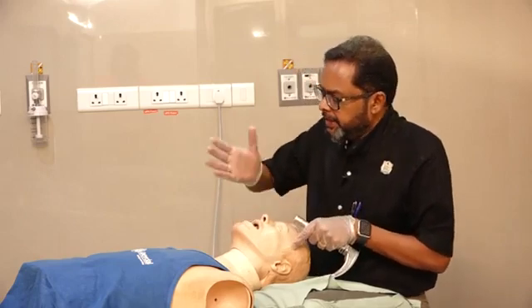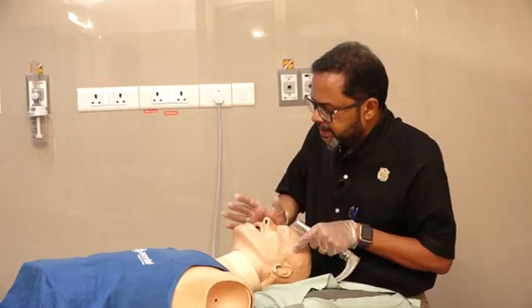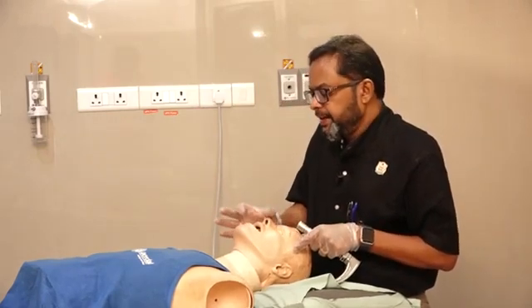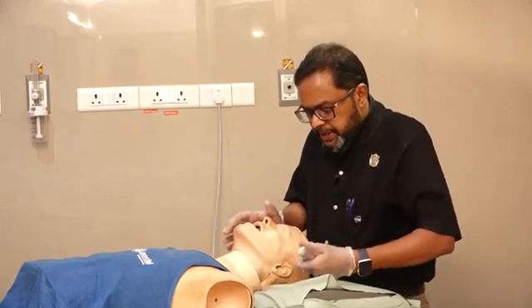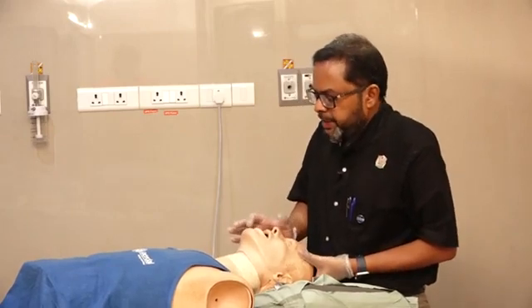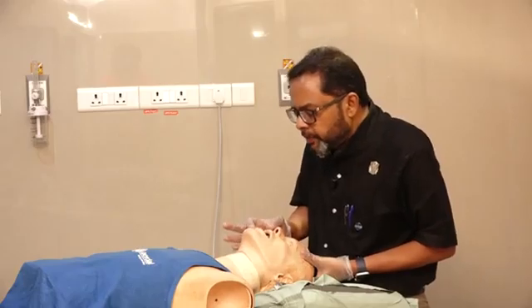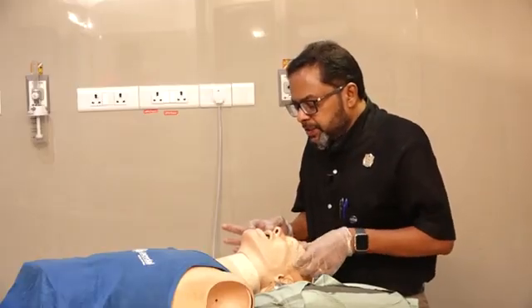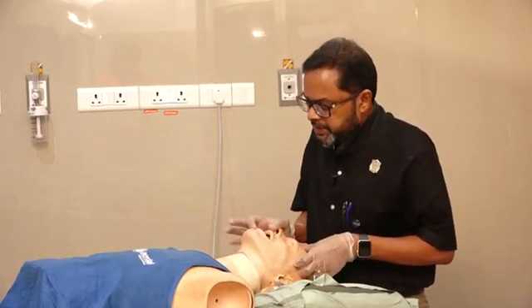Keep your right hand with the heel of the palm over the forehead, and you can use two fingers to perform the head tilt and hold it in position. With your index finger and thumb, you can open the airway. Once the airway is open, you can do a scissor maneuver as well, but this technique is the best one.